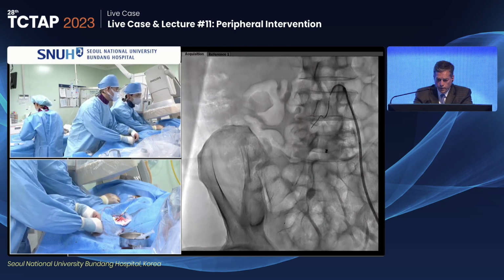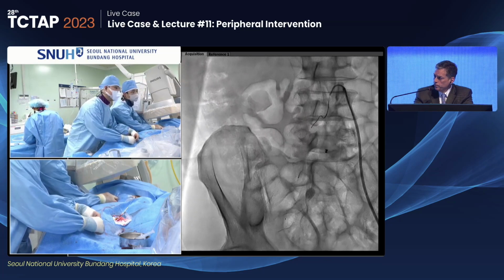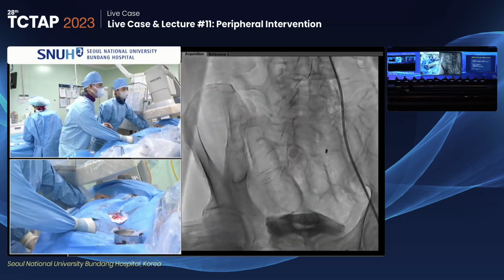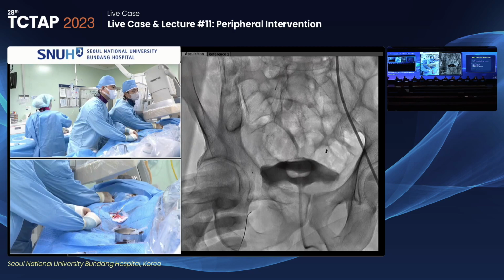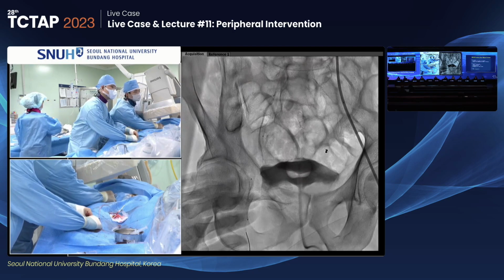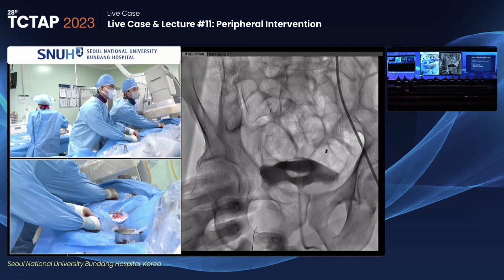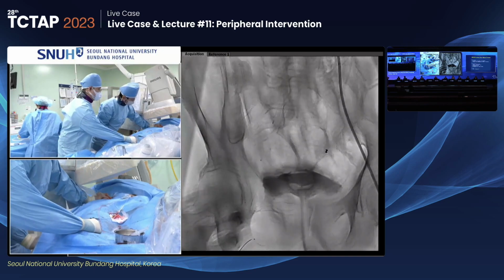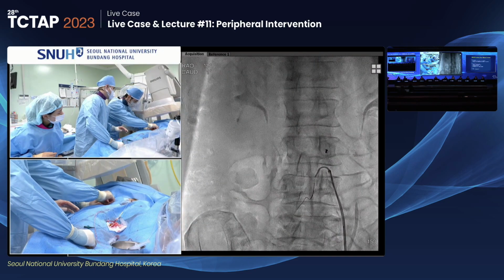Is there resistance? Maybe I think the CXI catheter is kinking at the common femoral artery. Yes, just pull it back, slightly, to straighten it out. Here it is kinked. Slowly, we'll watch it. Just a moment. Outside the vessel, it is kinked here.